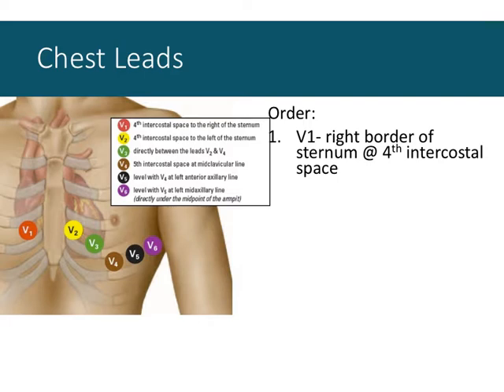And these are harder to place generally than the... No, they're not harder to place. You just need to landmark appropriately. And by landmark appropriately, I mean place V1, V2, V4, and V6, and then V3 and V5 go in the middle.